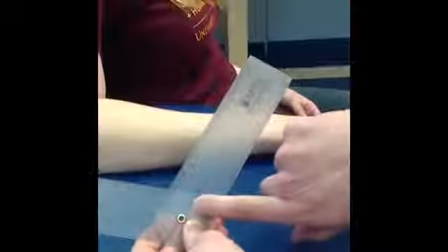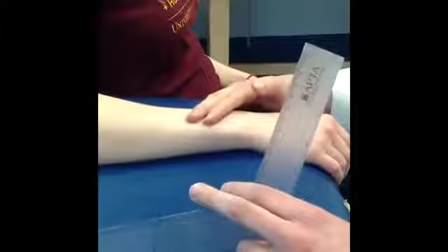I'm going to come in and set my goniometer right at 70 degrees, because that's where I thought it was. You see 70 right there. So then I'd ask her to, one more time, while I'm stabilizing, bring your hand back towards your elbow, please.